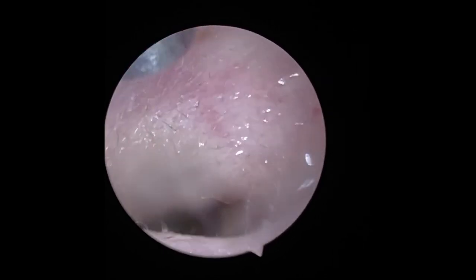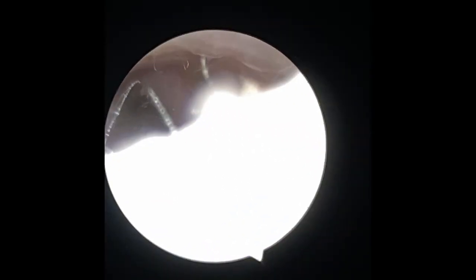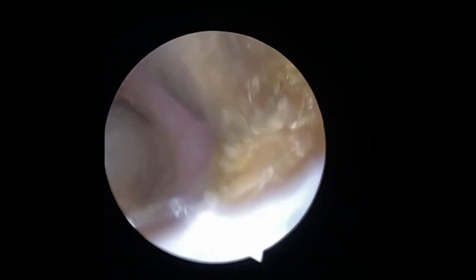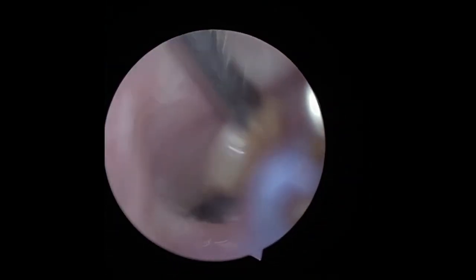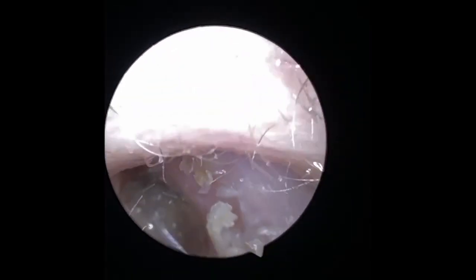Now because of the discomfort from the skin inflammation causing her to use the cream, I was actually never able to touch her right-hand side until this procedure — it was actually even too uncomfortable when I was looking inside the ear. But not today. Aria suddenly stopped using the Locoid cream as she didn't feel the itching and discomfort any longer, and now she was getting a stabbing pain and pressure which was running down her jaw, and she couldn't lie on this side anymore while sleeping from the blockage. So we've gone in and removed the bit on the right-hand side.